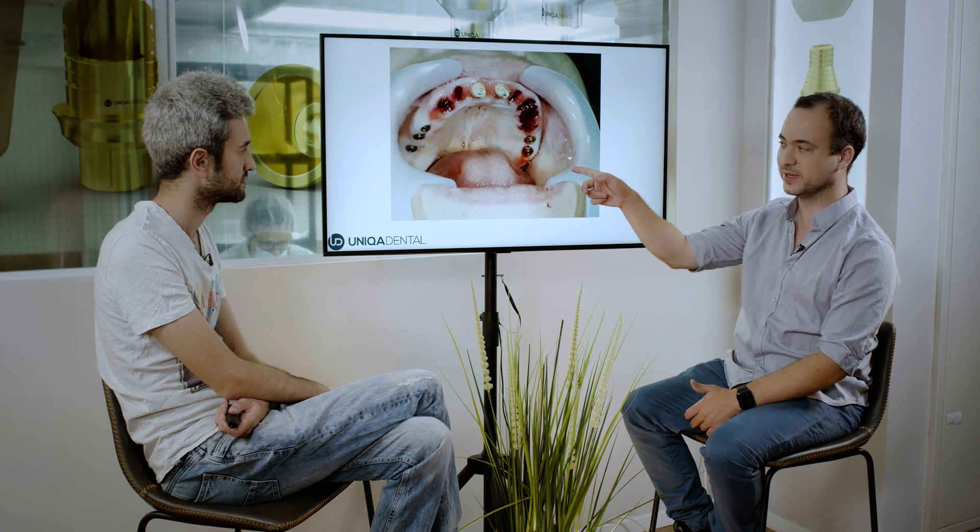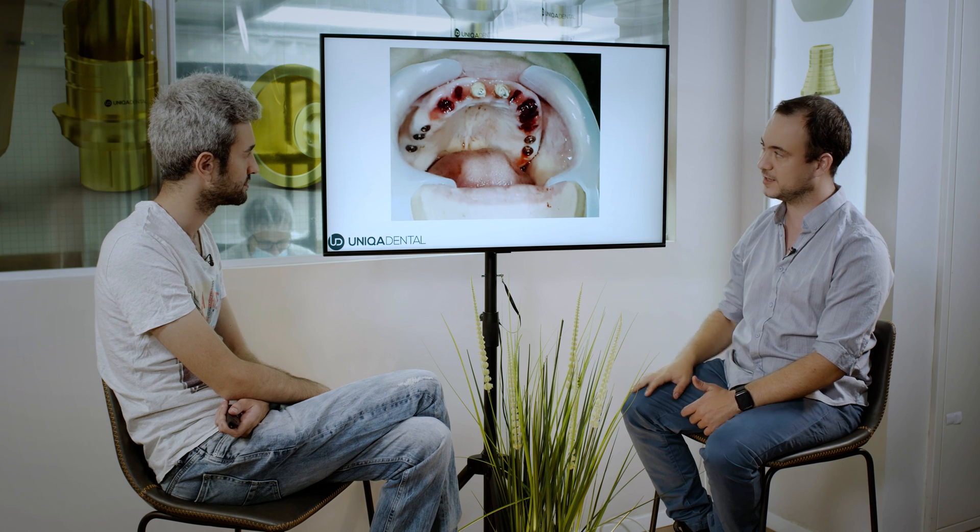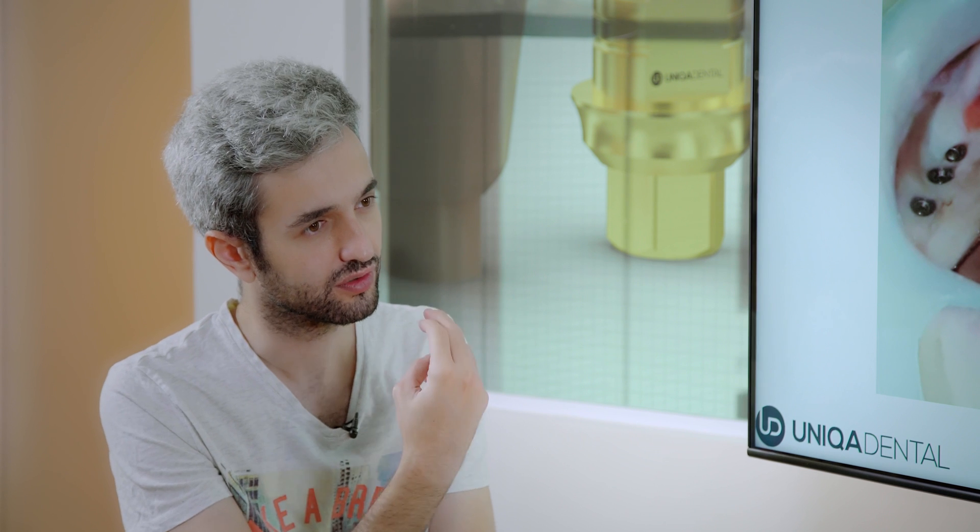So we left those two teeth remaining. We made a bridge on two implants on one side, three on the other side, and the frontal area on two teeth. The two frontal teeth will hold the bridge — even after root canal treatment, they're strong enough. For a temporary restoration of three to four months while waiting for the implants to go through osseointegration and the full healing process, it will hold.